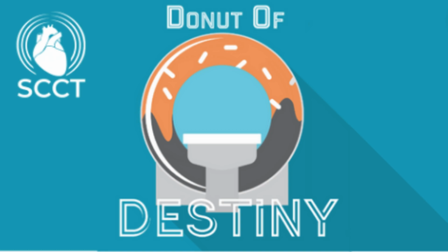Yeah, for me, outside of aortic and mitral disease, there are two areas that stand out. One is left atrial appendage occlusion, as you said, Nisha. For left atrial appendage occlusion, it's really about flow. The goal is to eliminate areas of slow blood movement that predispose to thrombus. And CFD can simulate washout and identify residual stagnation zones around an implanted device.